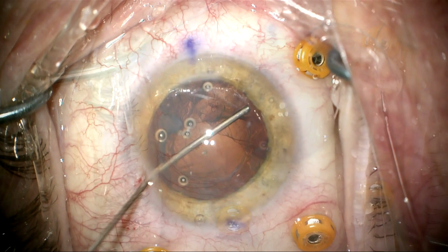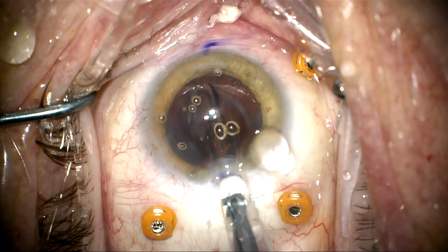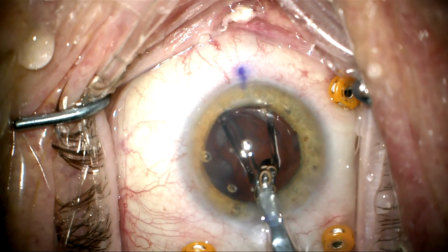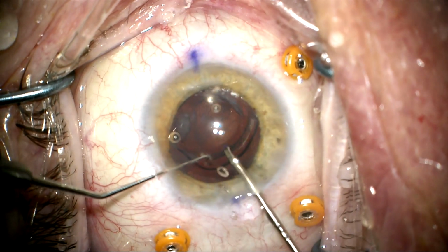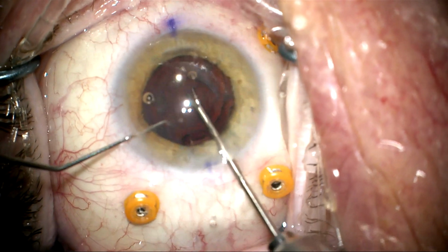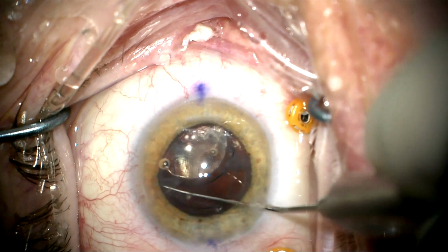Now we're going to try to inflate the capsular bag remnant, the donut of capsular bag, to create a place where we can put the single piece acrylic lens in the capsular bag remnant, under the anterior capsule and over the posterior capsule. We inject this and tuck it under the anterior capsule rim as we inject, and then grab the trailing haptic and try to position this under the anterior capsule and over the posterior capsule.